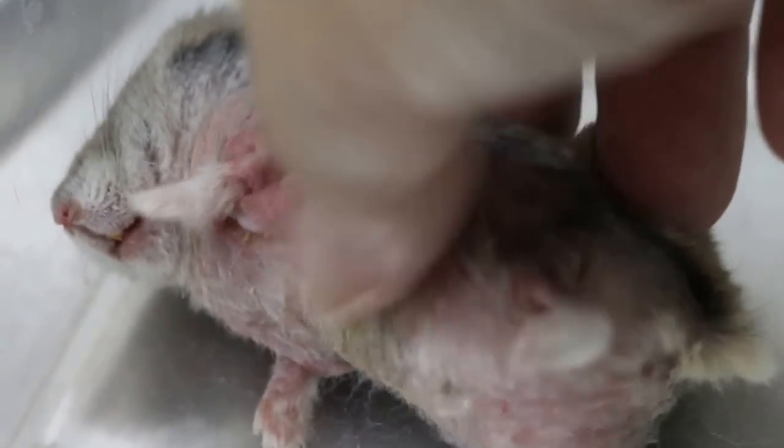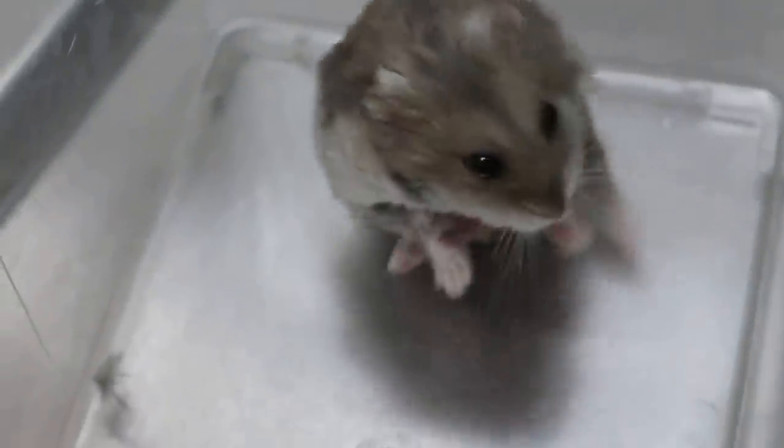And in most of the cases, once you resolve the infection of the elbows and relieve the pain, then after clipping the hair — same procedure as in dogs — there's ventilation now, and the owner can clean properly. There should be good results. We will check again in 2 weeks time. Case: eczema or fold eczema in the hamster elbow and the hot area, July 31st, 2016.